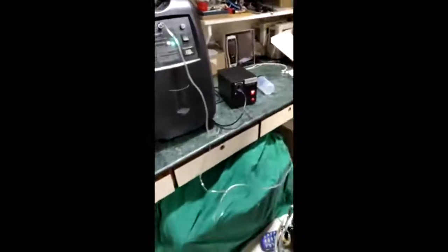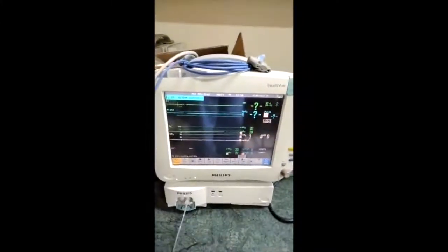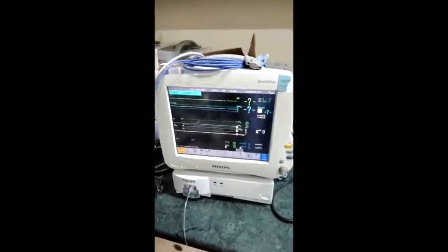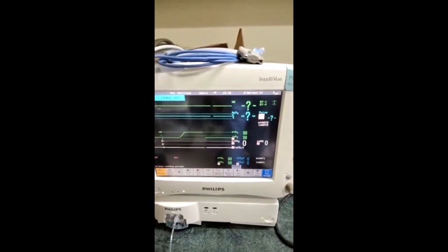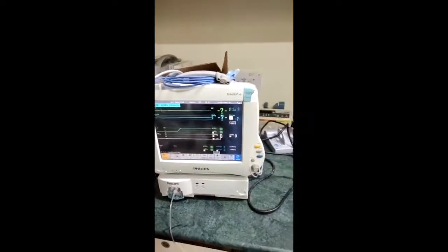To verify that the oxygen output port is delivering the intended 100% FiO2, we checked it with a gas monitor. The gas monitor is currently exposed to room air, showing FiO2 of 20%. Now attaching it to the output of the concentrator, you can see the oxygen concentration is steadily increasing — confirming this oxygen concentrator output is almost 99% FiO2. This was measured at 1 liter flow.